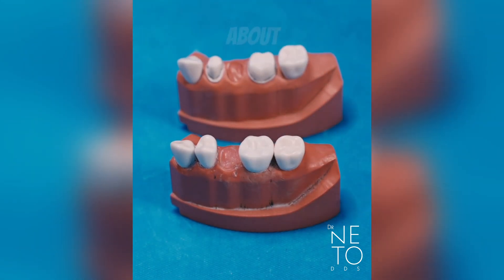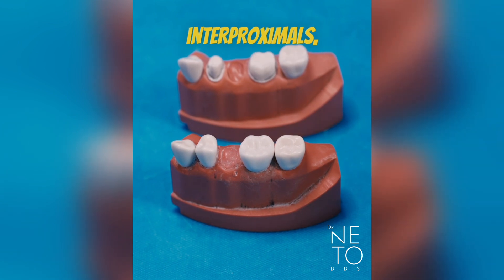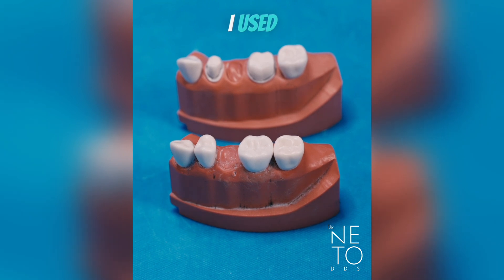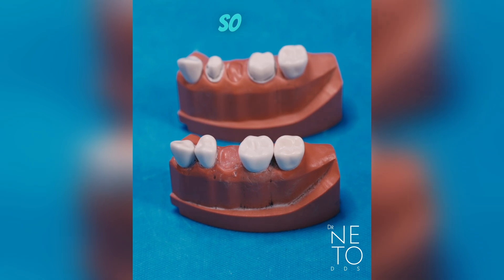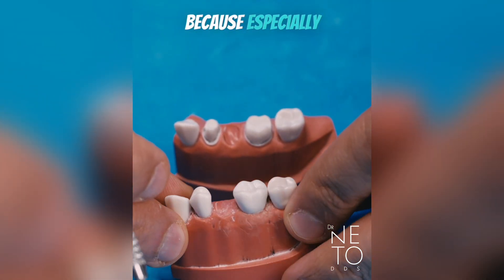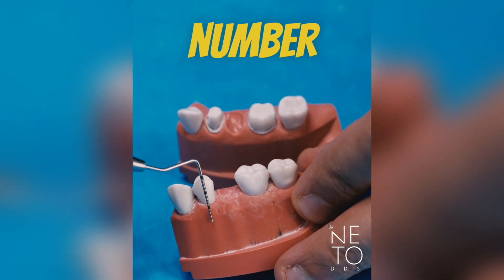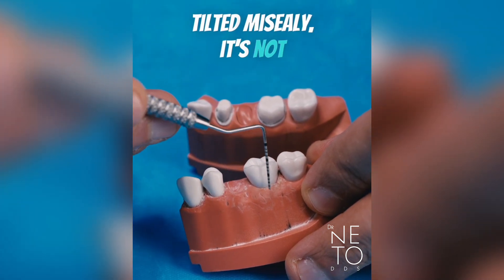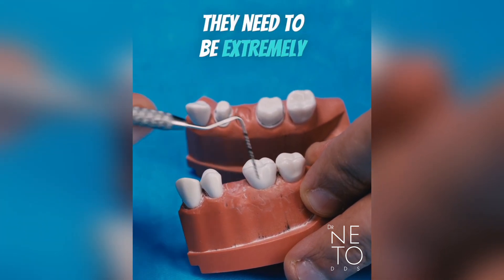Remember the last tip about the number nine — how to get the right taper for the interproximals by doing vertical lines parallel to the long axis. This is going to be even more important for a bridge, because typodont number five is not parallel — it's tilted mesially — and is not parallel to number three. For a bridge, they need to be extremely parallel to each other.